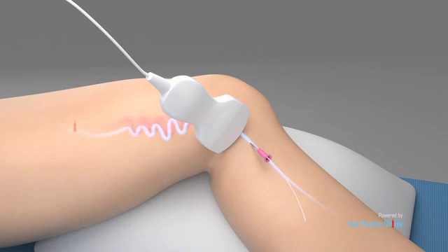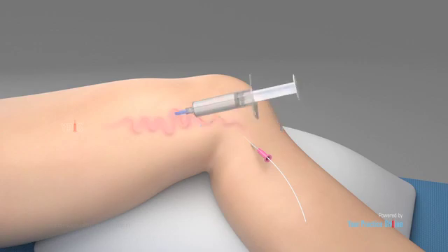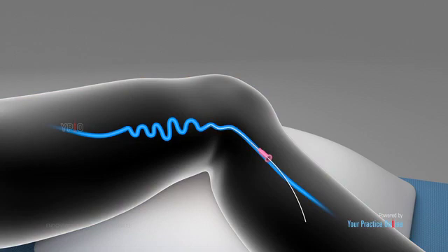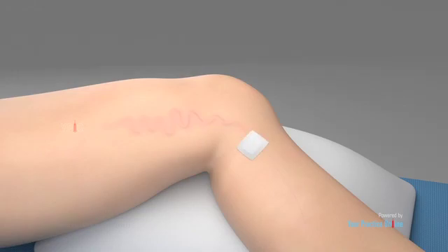A catheter, thin tube, providing the laser heat source, is placed into the affected vein. Additional numbing medication may be administered around the vein prior to ablating or destroying the varicose saphenous vein. Using imaging assistance, the catheter is guided to the treatment site, and the laser fiber at the end of the catheter is fired up to heat up the entire length of the vein and seal it closed. This results in stopping blood flow through the vein. The saphenous vein eventually shrinks and fades away, eliminating vein bulging at its source and allowing efficient blood circulation through other healthy veins. The catheter and laser are removed and the puncture hole is covered with a small dressing.